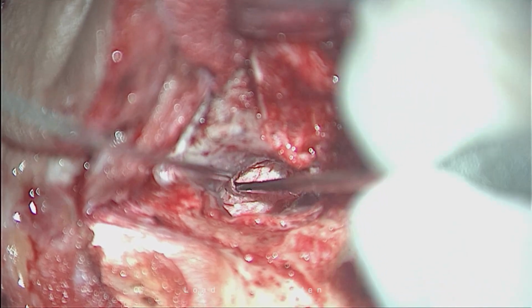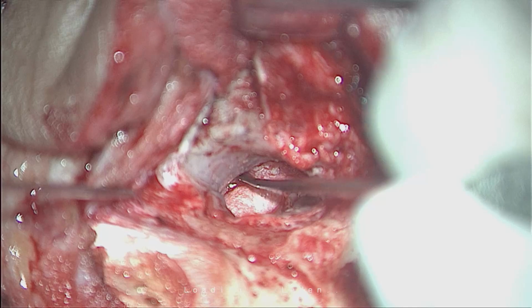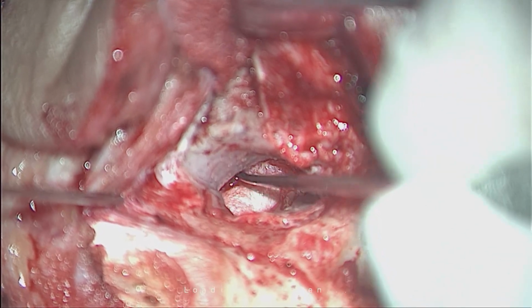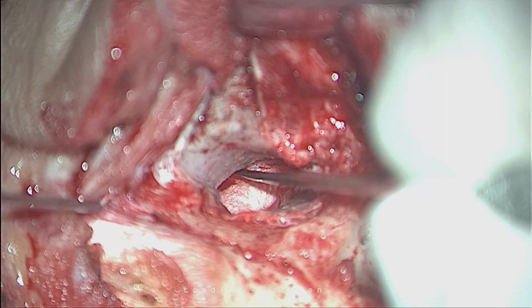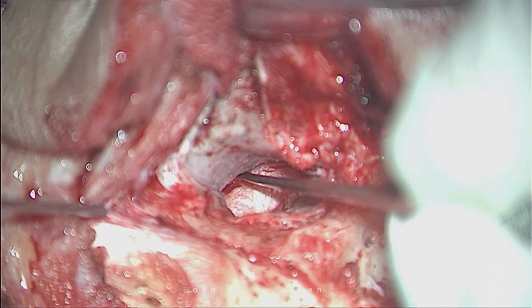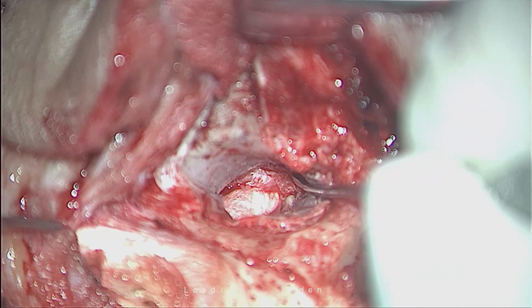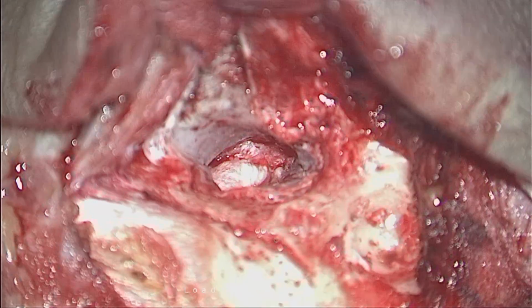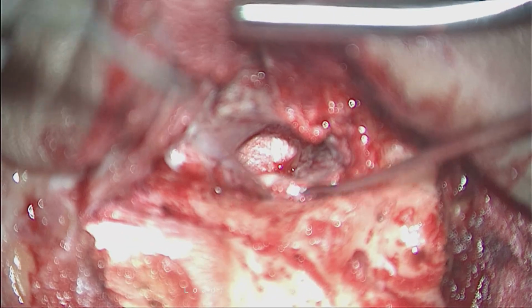This is anterior superiorly, this is anteriorly, everywhere. See this? The flap is coming over the graft. Can you see everywhere? This is the most physiologically placed graft. Physiologically in the sense that it is between the epithelium layer above, see this, and the mucosal layer below.